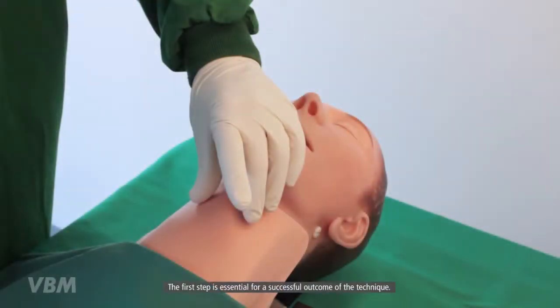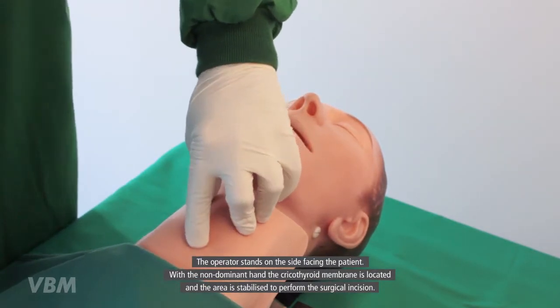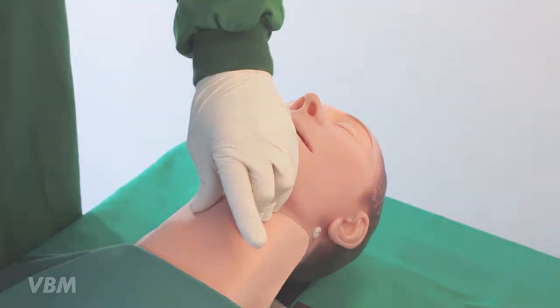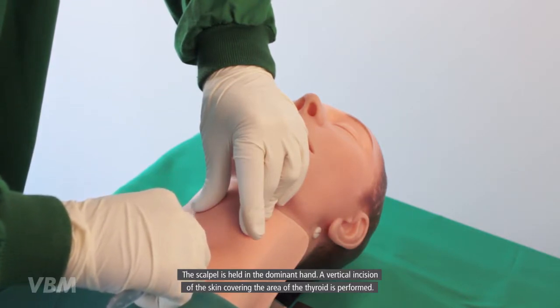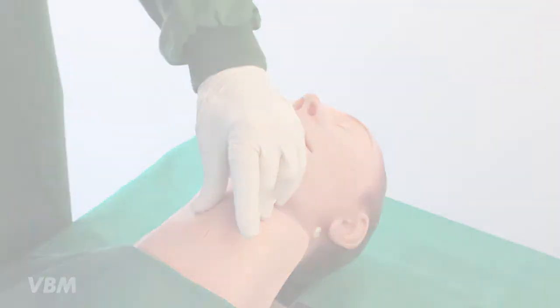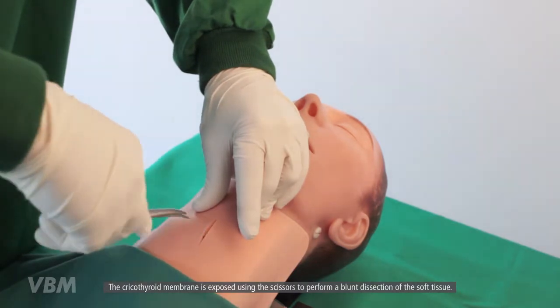The first step is essential for a successful outcome of the technique. The operator stands on the side facing the patient. With the non-dominant hand, the cricothyroid membrane is located and the area is stabilized to perform the surgical incision. The scalpel is held in the dominant hand. A vertical incision of the skin covering the area of the thyroid is performed.